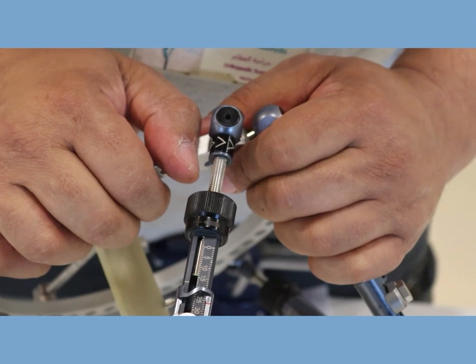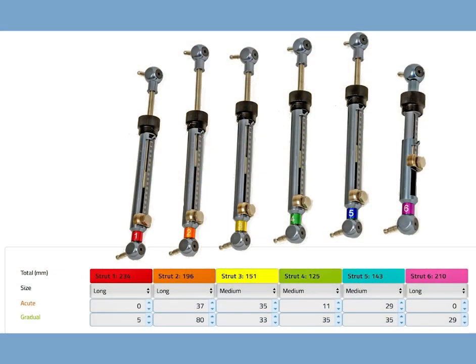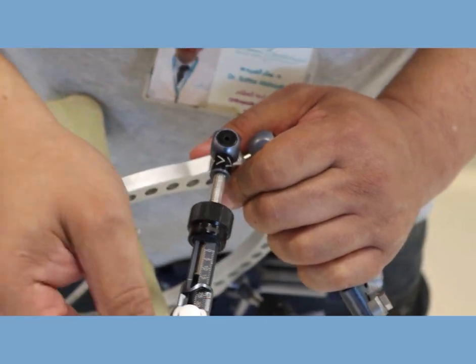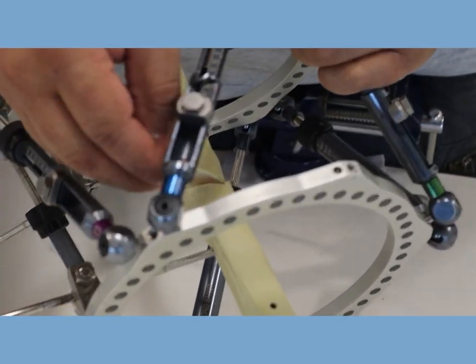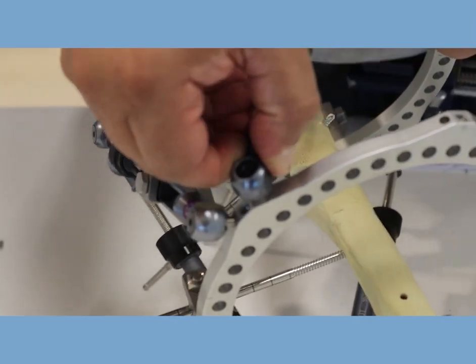I would like to emphasize the fact that the number gets smaller when the strut is lengthening is a unique feature for TL Hex frame and it can be very confusing. This is not the case with other frames such as TSF or Orthex frame. The last thing about the strut is that you have to number them. There are little markers, these are color coded from one till six, and these are usually clipped on the struts.